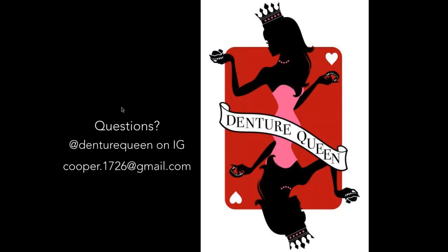The next question is, how is the bite confirmed if you are using bonded teeth? Is the denture rescanned and then checked, or do they just assume the bonding and placement is accurate? I am not sure if you're asking one of two situations. The first situation is, let's say you have tried in a bonded tooth setup and you feel like the bite is correct. What you would do is send that back, and I believe that they do rescan it, and then when they bond the teeth in, they scan it again and then color map it to ensure with quality control that it matches the original position. So that's what I think you are talking about there.